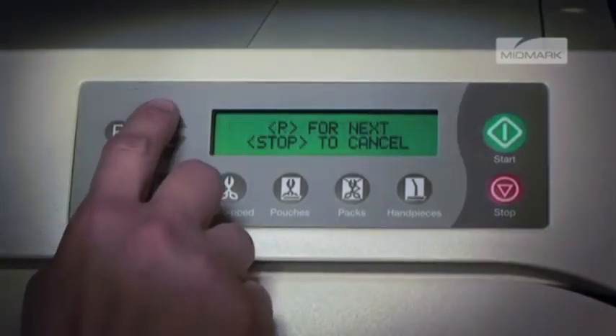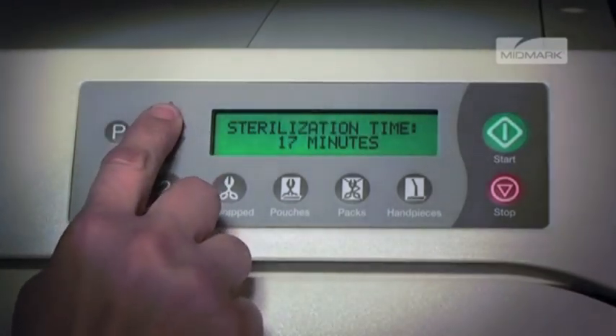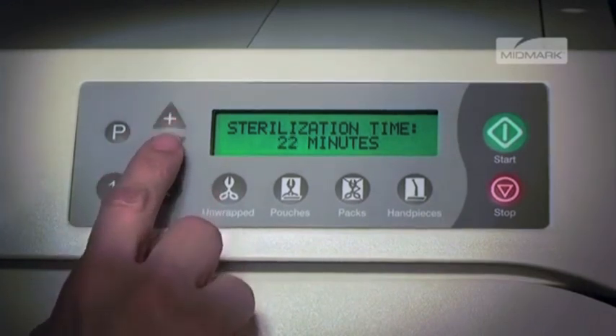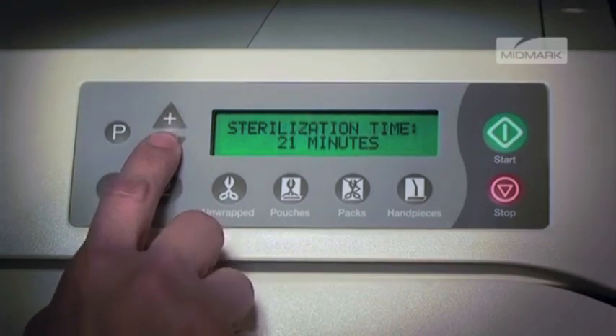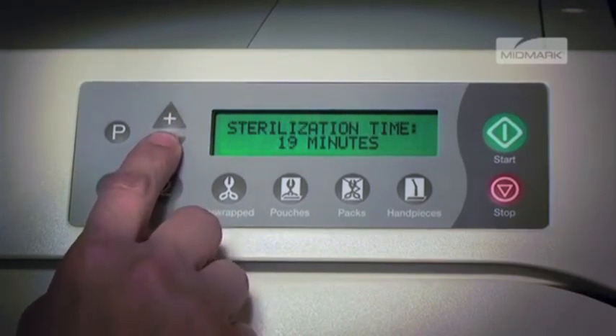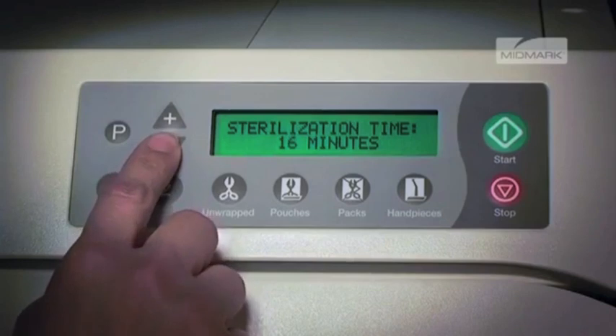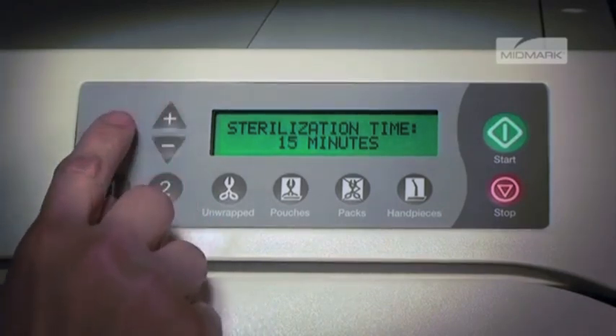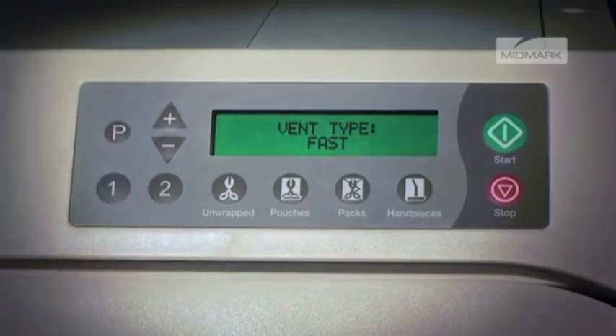Then you may press the plus or minus button to adjust the values, followed by P for next, or stop to cancel. By pushing the plus or minus buttons, the sterilization time can be changed from 3 to 90 minutes in one-minute increments. When the desired time is reached, press P to store it and progress to vent type.